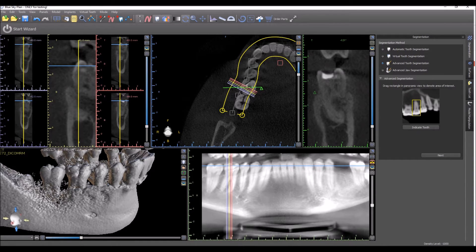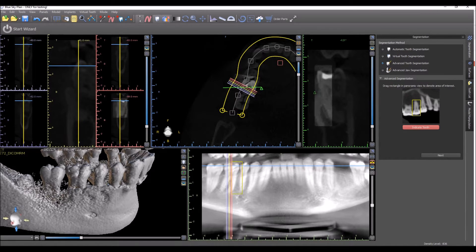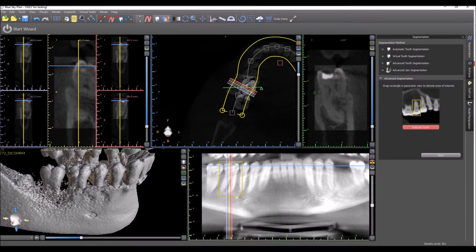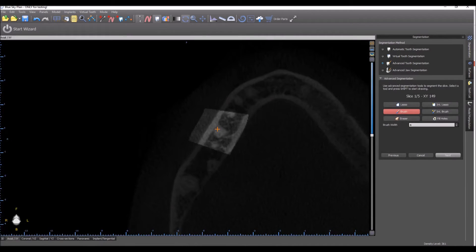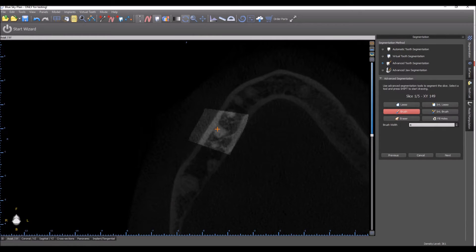The process starts by pressing the Indicate Tooth button and drawing a rectangle around the tooth that you would like to extract or segment. Pressing Next brings up our segmentation panel. We can see that the software is going to show us five slices. Here we're going to indicate where the tooth is, and after we do the five slices, the software is going to compute the rest.